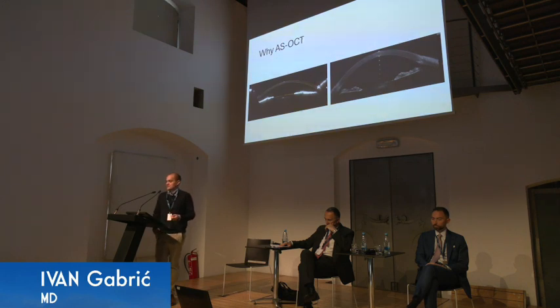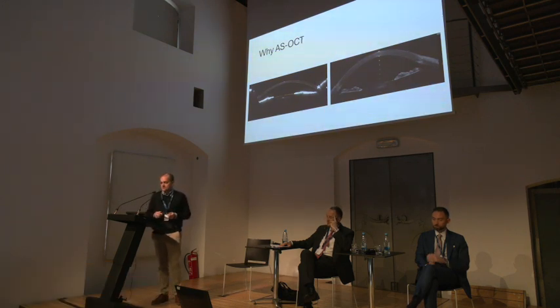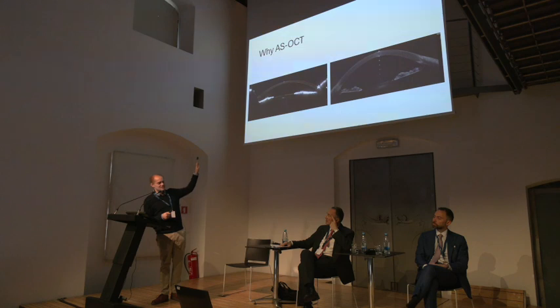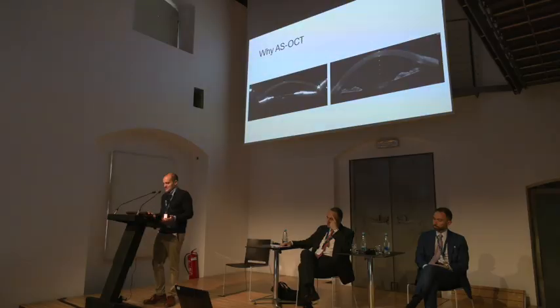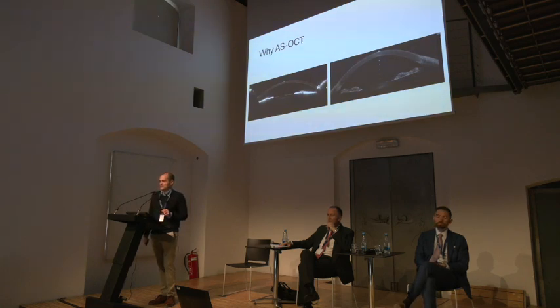Why anterior segment OCT? We saw some examples from Professor Hafezi, but this is an image of a normal looking eye. The image on the left and the image on the right don't even look similar. They're completely different. The quality of the image, the level of detail, you can tell that that eye is okay, but everything else is software.